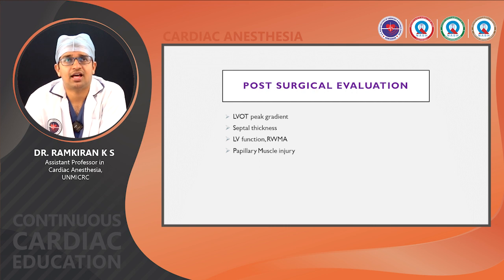The other parts of post-surgical evaluation are the LVOT peak gradient, the septal thickness after resection, LV function, RWMA, and any papillary muscle injury, which has to be addressed.